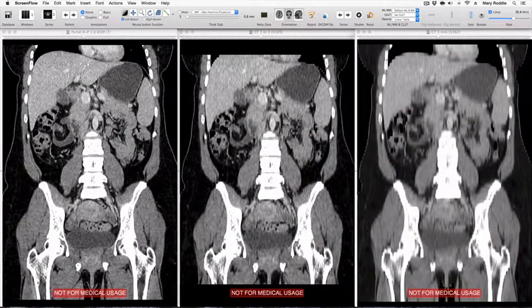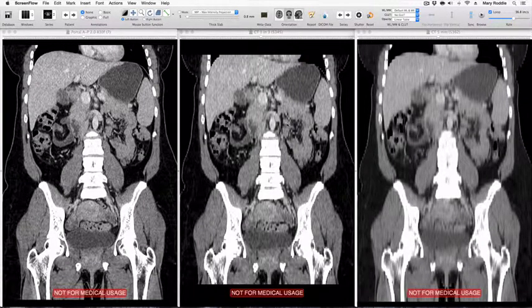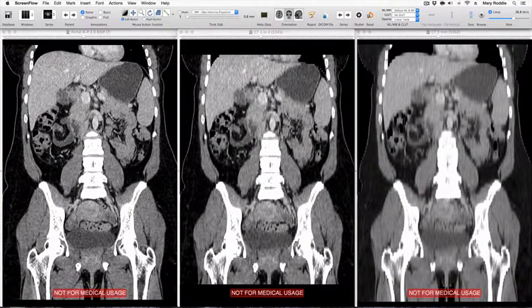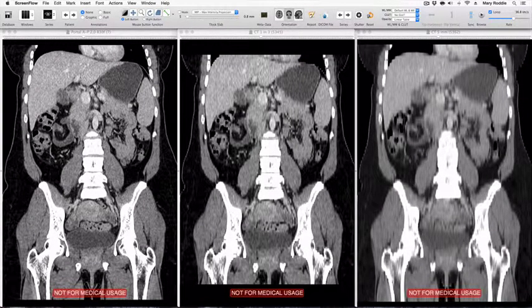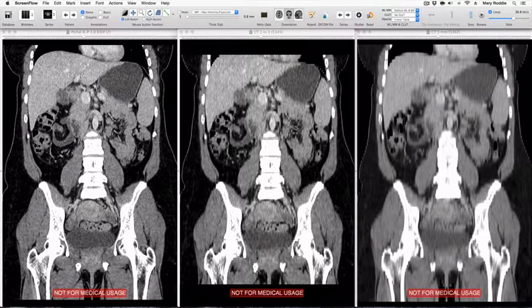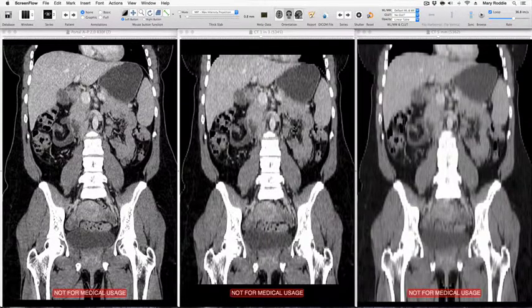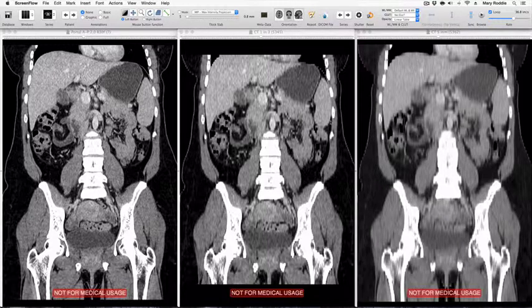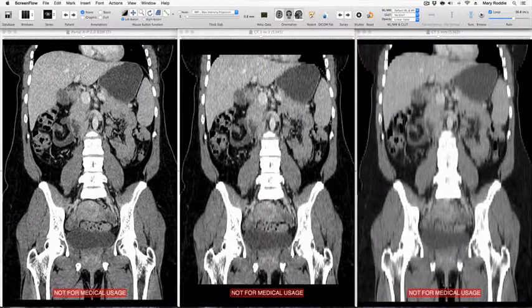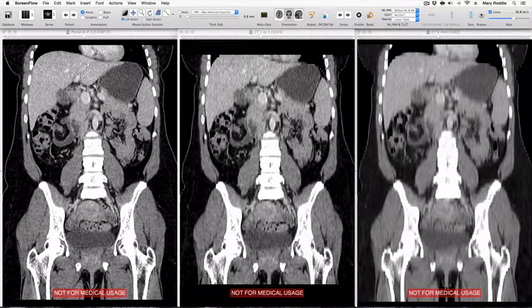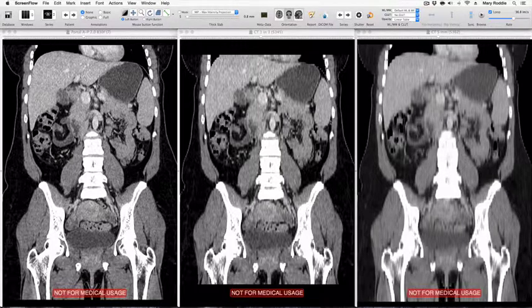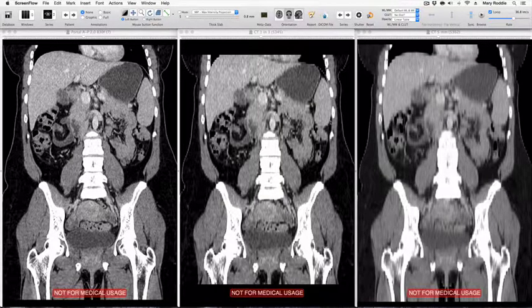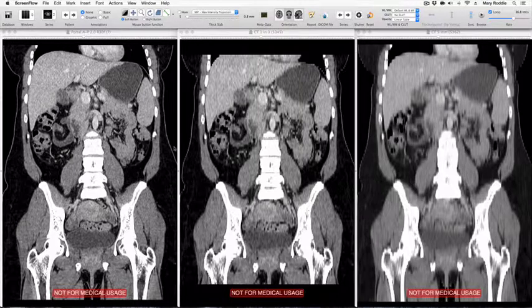If we make coronal reconstructions of these three series you will see that there is significant loss of image quality in both types of image reduction strategy. Therefore, if you want to save coronal or sagittal reconstructions of your images it's best to do that from the full data set.